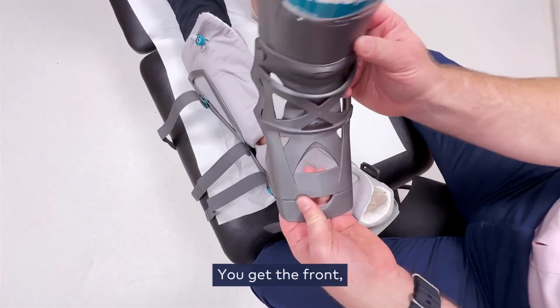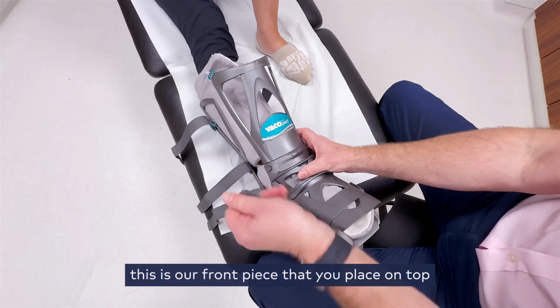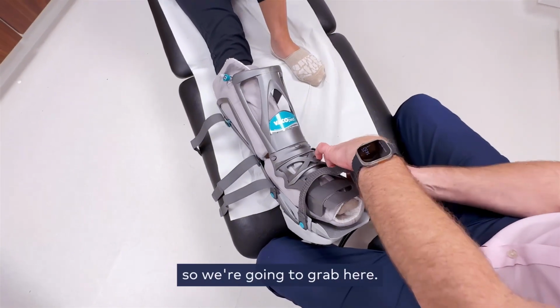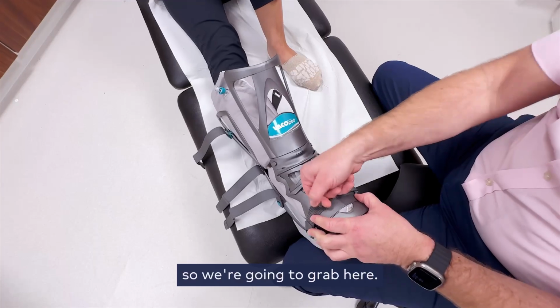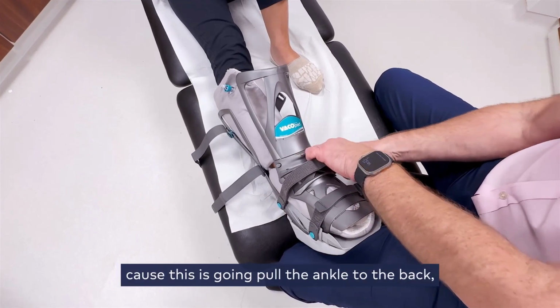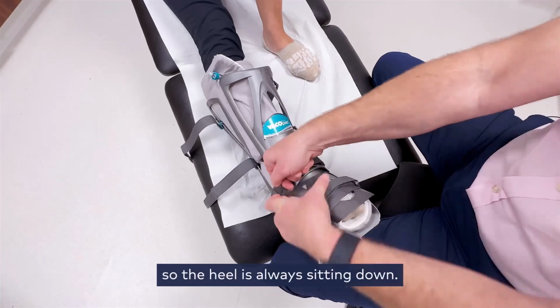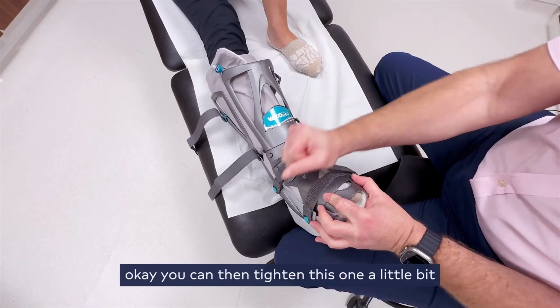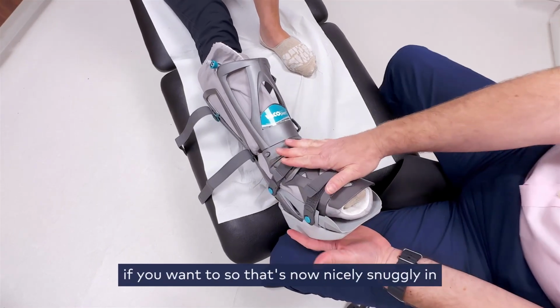You get the front. This is our front piece that you place on top. And this is just like a ski boot. We're going to place this now onto the top. So we're going to grab here. The most important one is this one around the ankle, because this is going to pull the ankle to the back. So the heel is all the way sitting down. Can you feel your heel at the back there? Okay, and you can then tighten this one a little bit if you want to. So that's now nicely snugly in.